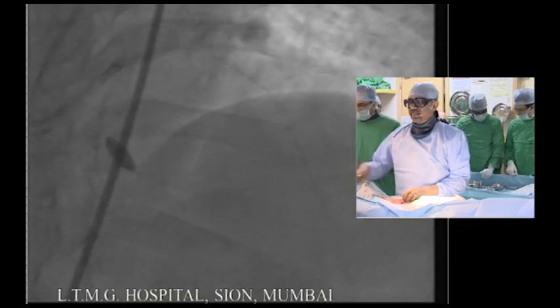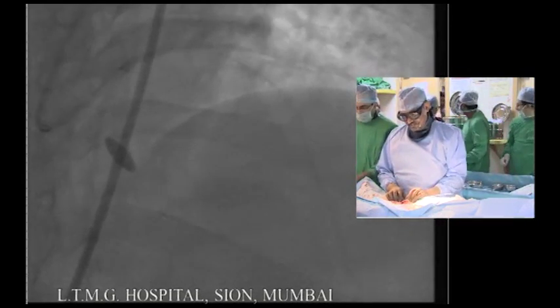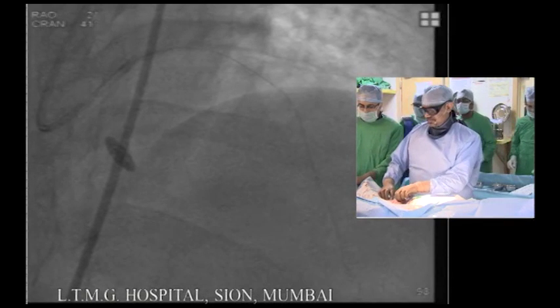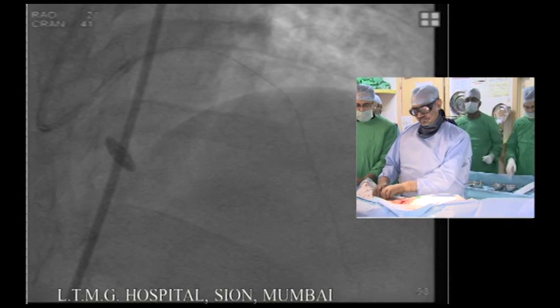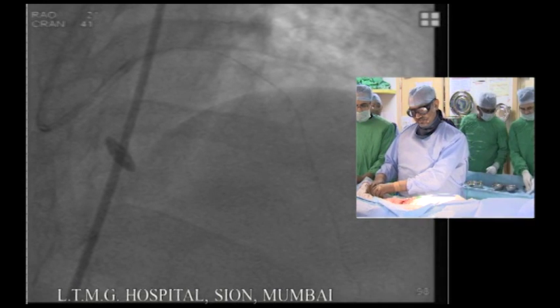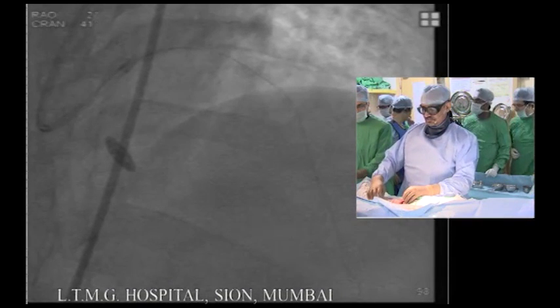Mahajan, do you have a guideliner here? That could come to your rescue. Do they have guideliners in India? Yes, guideliner is there. Or get your guide to support you well. Rotate clockwise, push your guide deep in and rotate the stent as you go in. That might help.